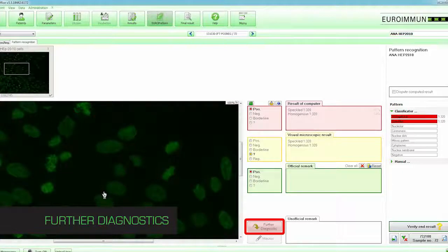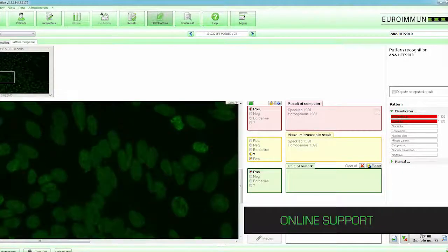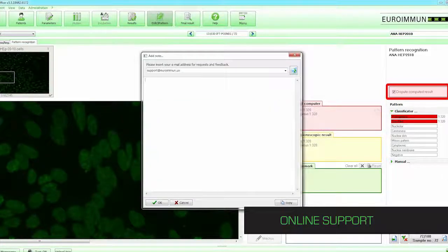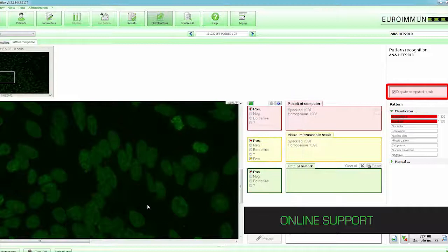The Further Diagnostics button allows the sample to be retested without changing the original examination. If the laboratory technologist should need assistance with a difficult sample, the images and a query can be forwarded to Euroimmune experts for analysis and further support. With the click of a button, a window will pop up requesting an email address and a brief description of the issue. Once submitted, the result is sent instantly to Euroimmune ANA experts, who will correspond directly with the technologist.